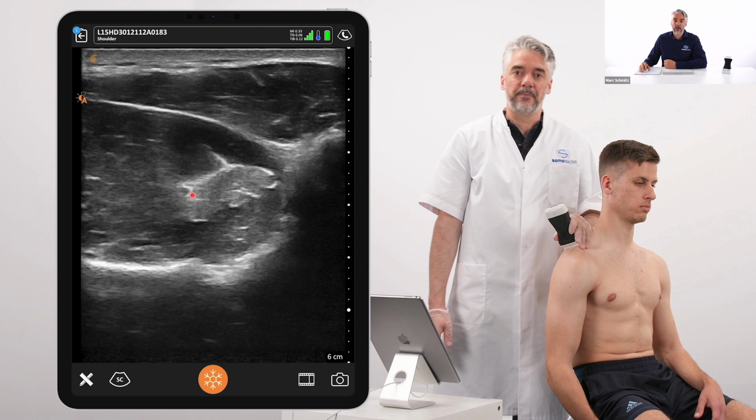If we're screening for fatty infiltration, there are 3 assessment points. Number 1, look at how crispy, thin, and hyperechoic the aponeurosis is. This is normal. With atrophy and fatty infiltration, it really blurs out and becomes a very vague structure. You don't see the crispy outlines. Checkpoint 2 is to compare the echogenicity with the overlying muscle.